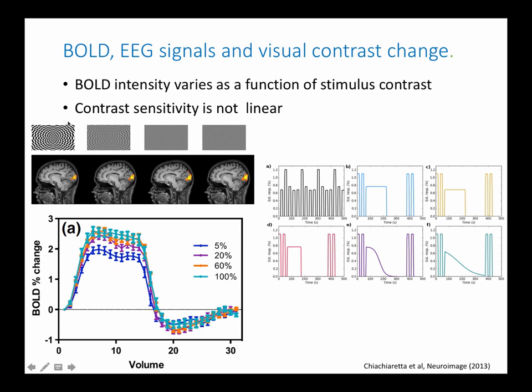I think people are familiar with the visual stimulus, which is a flickering checkerboard. It's a little bit annoying if it's at full contrast, but you can actually reduce the contrast quite nicely. So you can manipulate the contrast, and manipulate your BOLD signal. You can imagine this is a surrogate of doing something like a drug response, where you get a declining or a slow slope. You can manipulate it either in a block design with long blocks, or with these nice little ramp things.